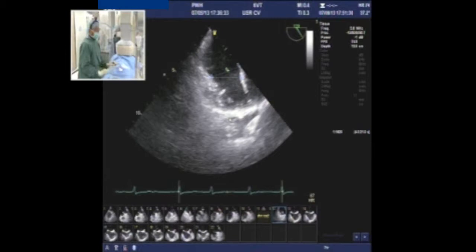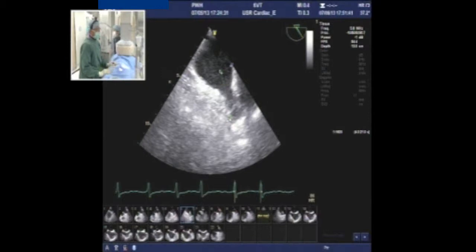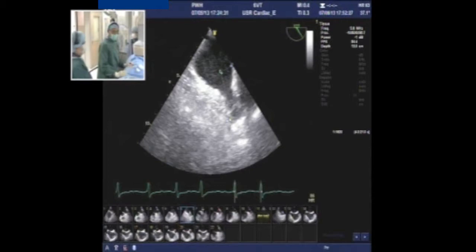We need to keep in mind that the disc will be at least 6 millimeters larger than the lobe we select. Our initial measurement is 30mm. We are planning to use the ACP device — the largest available is 30mm. The second-generation Amulet device goes up to 34mm, which is a clear advantage. If we find 30mm at the landing zone, we may need to deliver the device a bit more distally. We have no choice but to select the 30mm device.